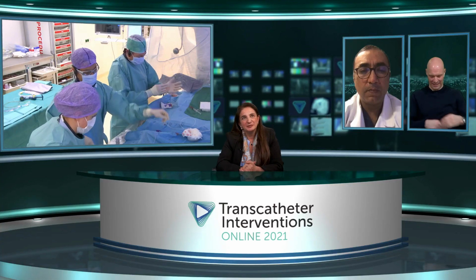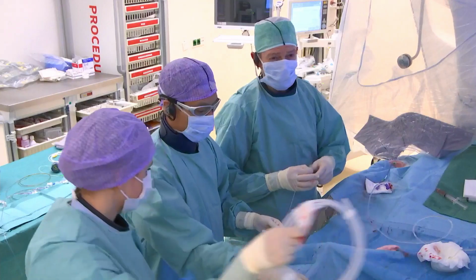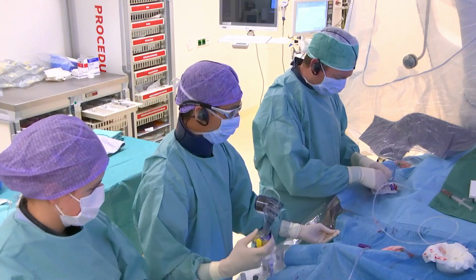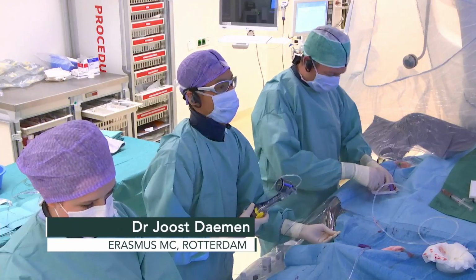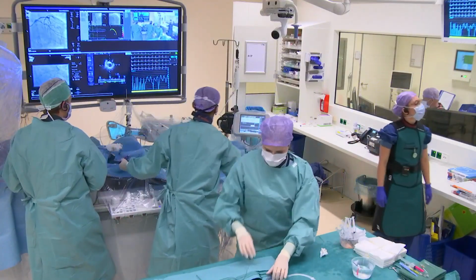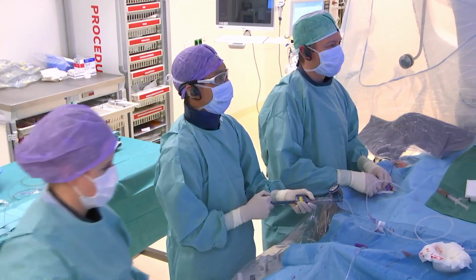Hi, welcome back. We proceeded with a bit of pre-dilatation of the distal part and the proximal part with a 2.5 and 3.0 non-compliant balloon. We stented the distal part based on the IVUS with a 3.0 by 18 Orsiro stent. We are now proceeding with the proximal part, where we also did some pre-dilatation. Based on the IVUS, we decided to put in a 4.0 by 35 stent. We're now going to do some post-dilatation here with a 4.0 non-compliant balloon.